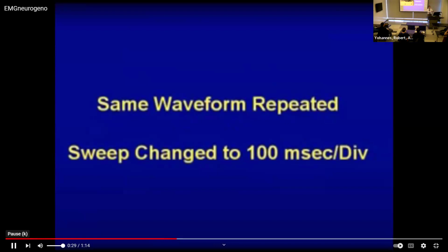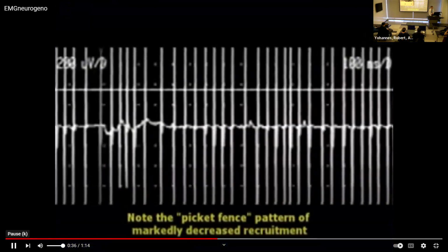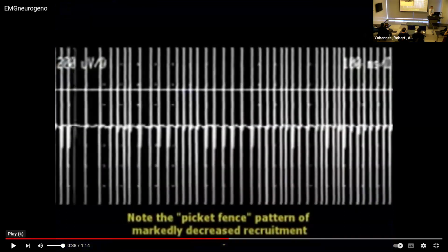So they're changing the way we look at it. They're not changing the force here, we're just changing the way that we're looking at it. This is what's called a picket fence. So basically, one unit is trying to compensate for the loss of its buddies by increasing the rate. So it's the same unit firing at a higher rate. And this is called picket fence. Notice that we have between them back to the baseline. So this appearance is neurogenic.